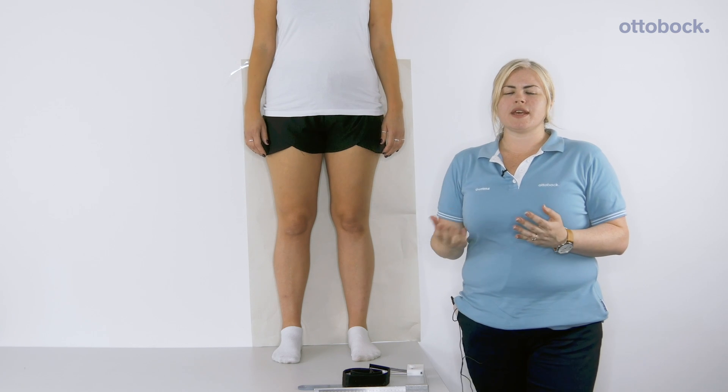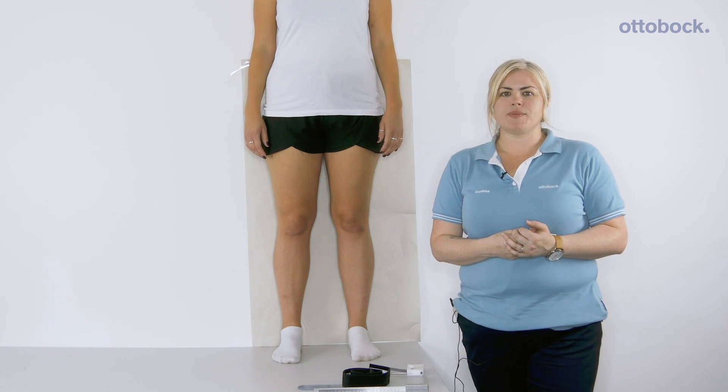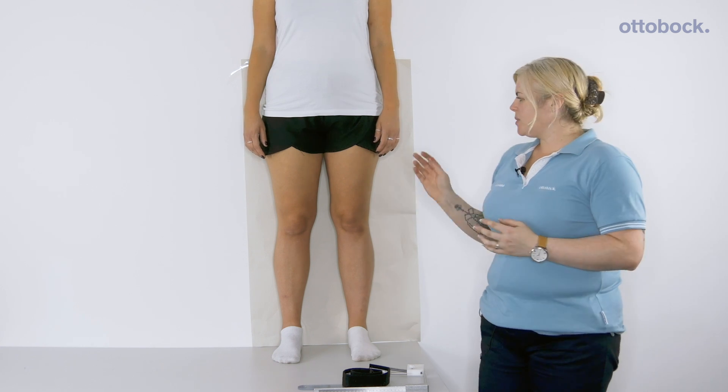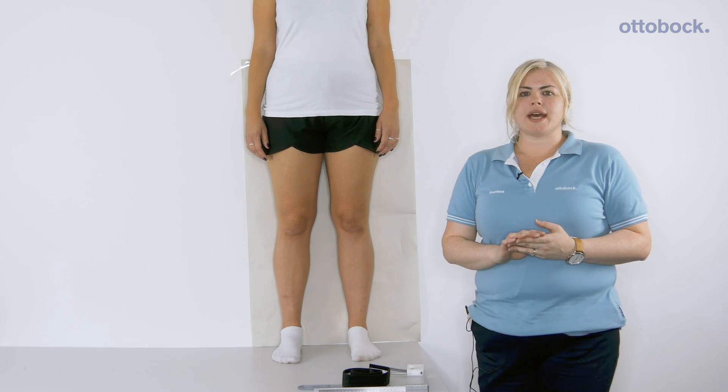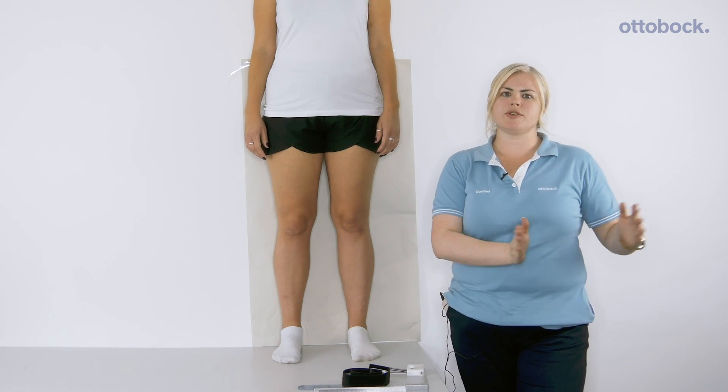If the Free Walk is appropriate for the patient, you will then need to measure them with either a cast or a draught. Ideally we would ask for the draught to be done against the wall, weight bearing if possible. If you are going to do it laying, make sure the leg is not too abducted.